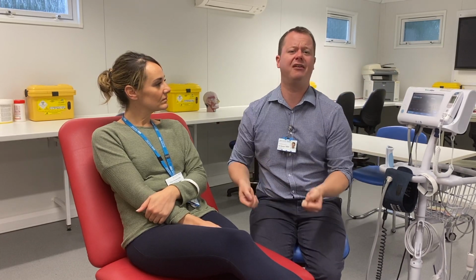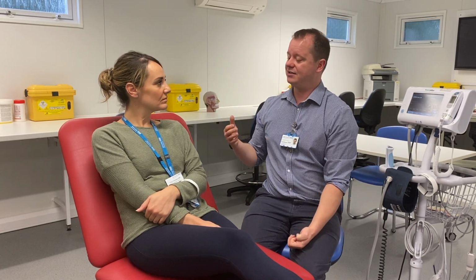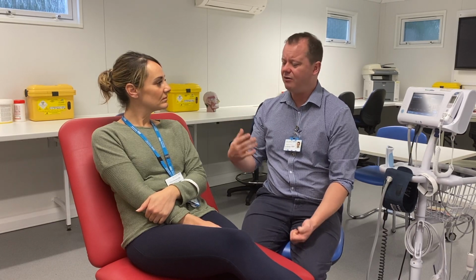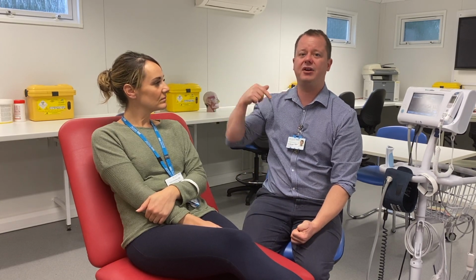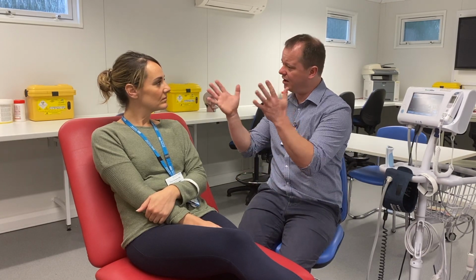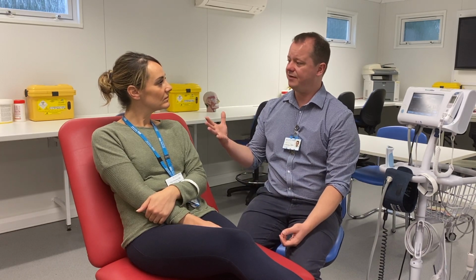It's important to point out that before you do any procedure on a patient, it's really important that you introduce yourself to the patient. Say, hi, my name's Tom, also say your role, make sure that they know why you're there and that they understand what it is that you're going to be doing and that you gain consent for doing that. So I would say, hi, my name's Tom, I'm a nurse, I'm here to record your vital signs, which is your blood pressure, pulse, respirations, SATs and temperature. Is it okay if I do that?